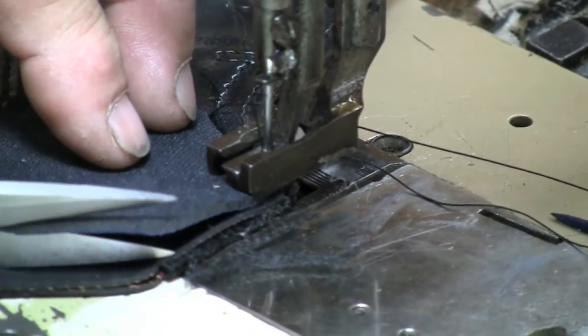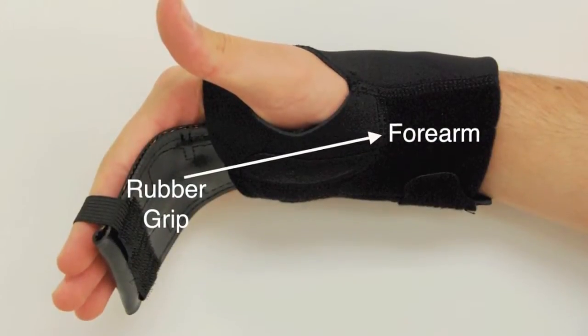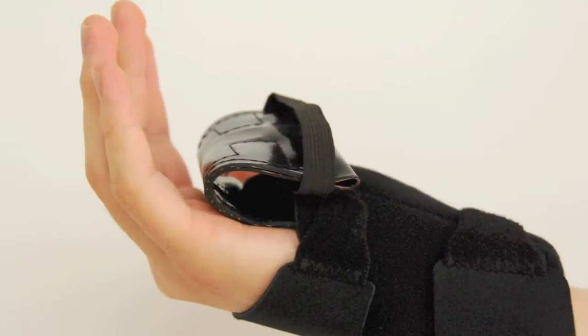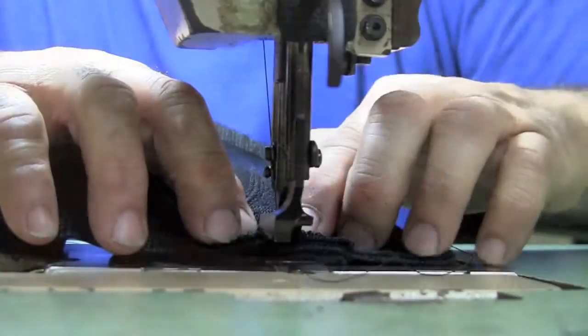A Velcro strap was then sewn into the bottom of the glove to secure the Hold to the user's wrist. A rubberized material was cut and used as the rubber grip to transfer weight from the fingers to the forearm. An elastic strap was then sewn to the end of the rubber grip to secure it to the user's fingers, and Velcro was added to the end of the grip to allow it to fold inward.